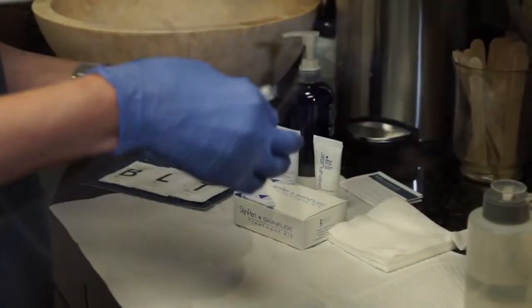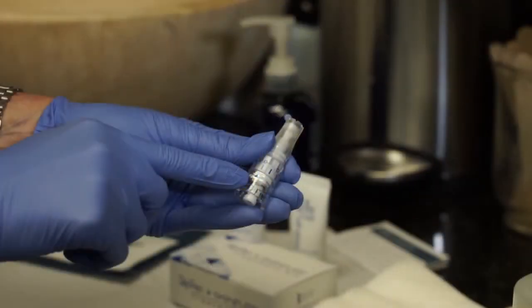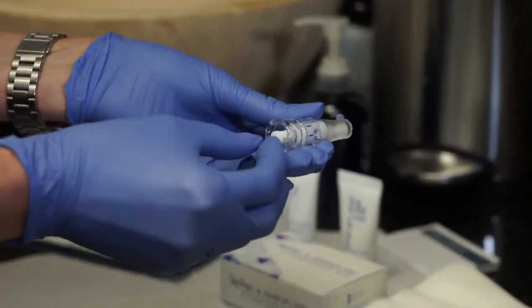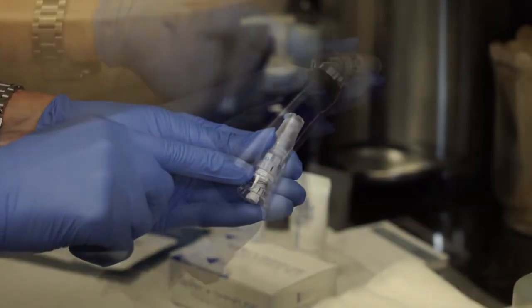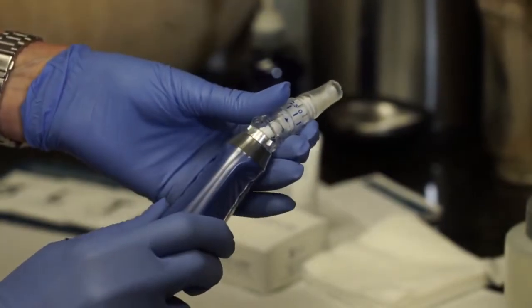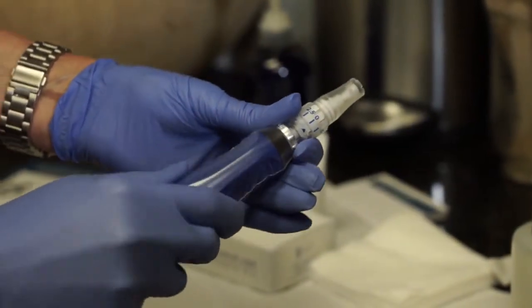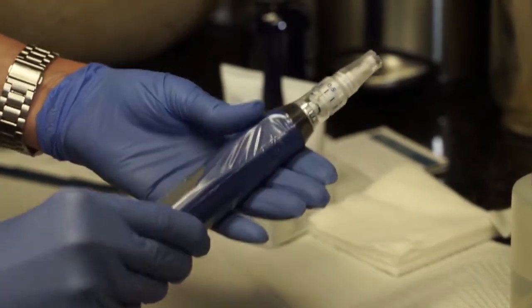Then, identify both the center seam on the device and the depth arrow pointing to 0 on the cartridge. The cartridge will only fit on the device when the arrow is at a 1/4 counterclockwise turn off the center seam on the device, which makes the center seam appear to be more in line with the 2.5 mm depth setting. The reason being, once in place, the device will be turned clockwise to lock into place, and the center seam will align with the arrow that points to 0.